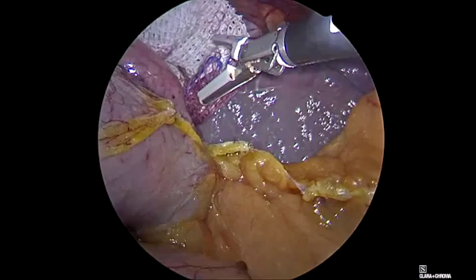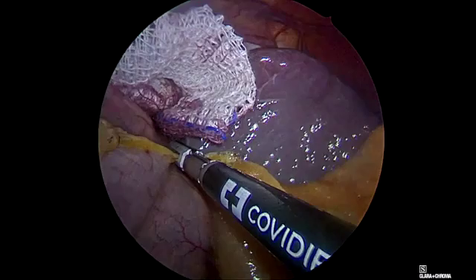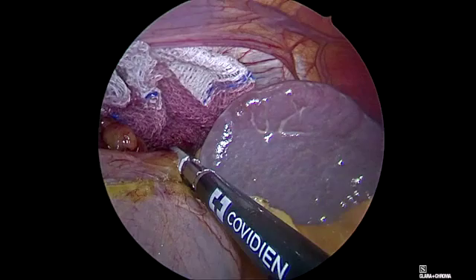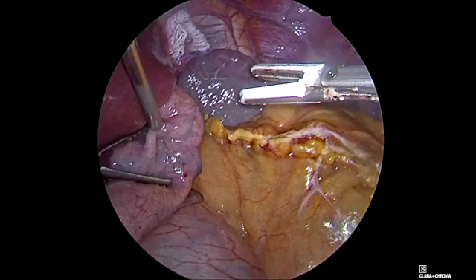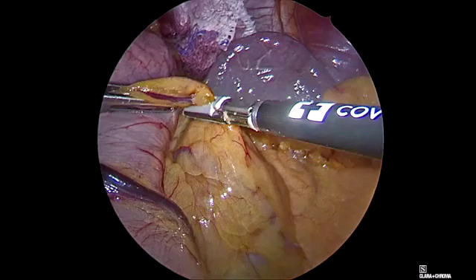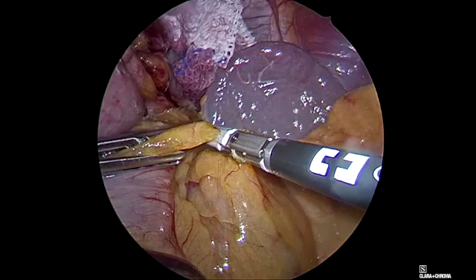Now from the spleen, making it a lot easier for the surgeon to separate one from another. Here we see an active liver retractor controlled by the hand of one of the assistants. We always look for the posterior gastric artery and vein, which comes from the splenic artery. It's important to seal and cut it.